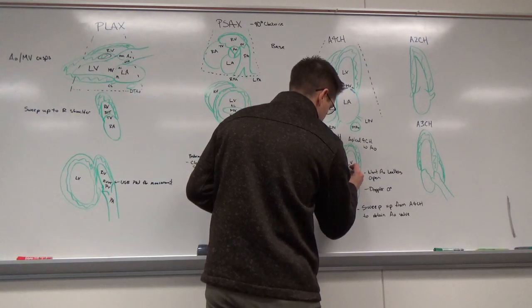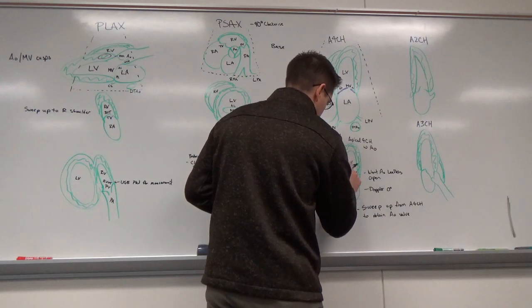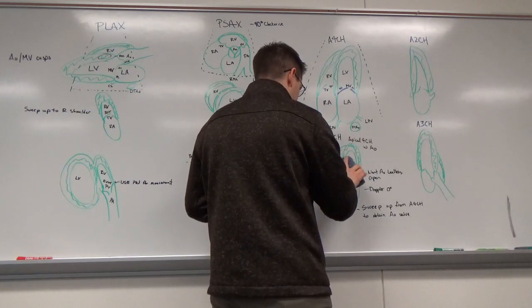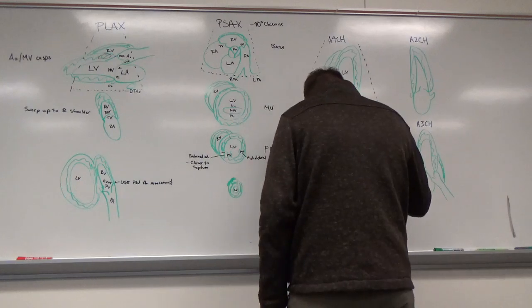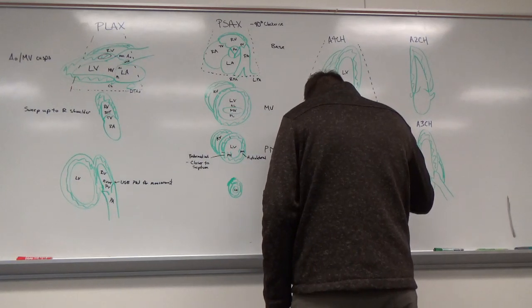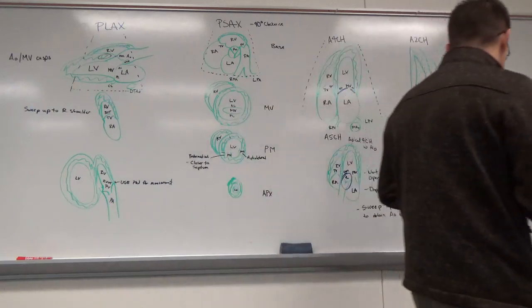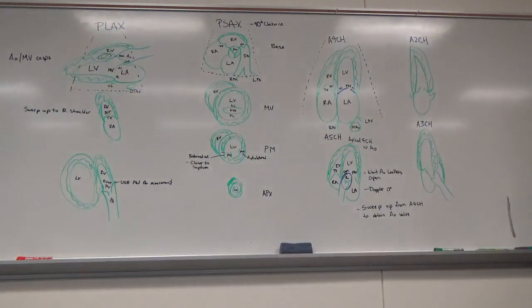Okay. So when we Doppler these, we always do a comparison of the before to the after. Okay. So we pulse wave that because it's range specific, and then we do a Doppler through the valve with continuous wave Doppler.